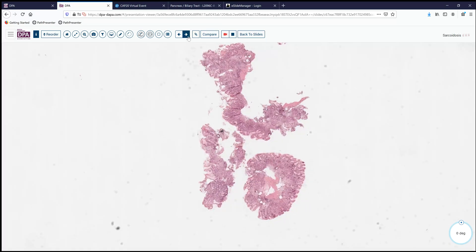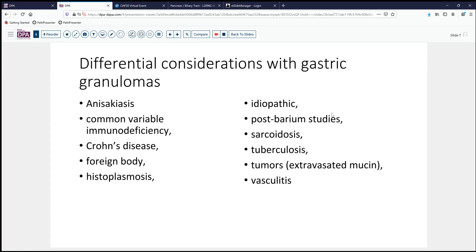Several areas in the stomach are involved by granulomatous inflammation with intestinal metaplasia and mixed chronic inflammation. When thinking about gastric granulomas, there are a number of common and less common entities: in the Orient or people consuming raw fish, anisakiasis is a consideration though usually localized. Common variable immunodeficiency, Crohn's disease, foreign bodies, histoplasmosis, idiopathic forms, and iatrogenic causes related to barium are all possibilities.